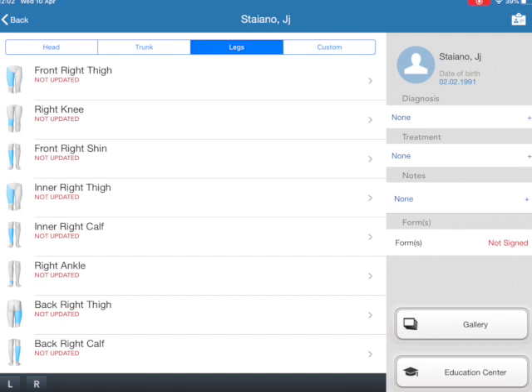The main thing is that you get the photo on, and it gets on the right day. You can take the photos on the camera on your phone, and then upload it to RXPhoto if there's not a good internet connection at the hospital or where you are, and then delete it off your phone. But it's better to just do it direct onto RXPhoto.